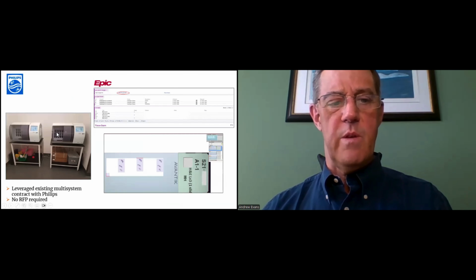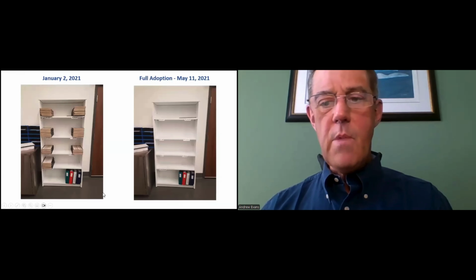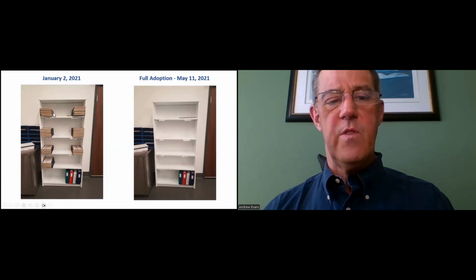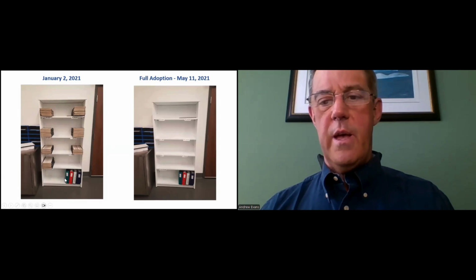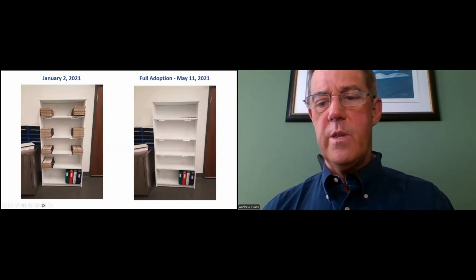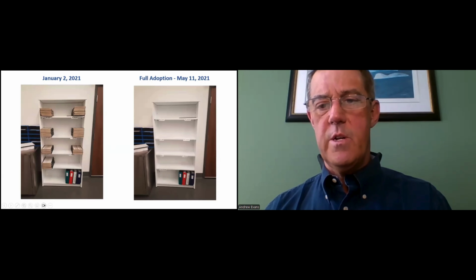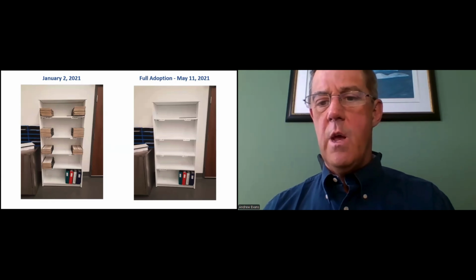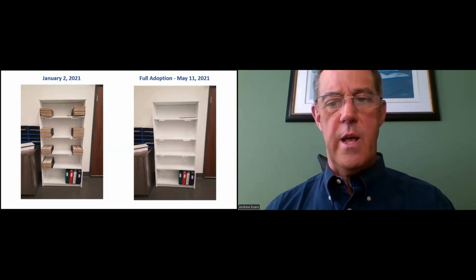This is our system. So we have Philips scanners integrated with Epic AP Beaker. And this is the slide I show quite frequently about what full adoption looks like. So prior to full adoption, glass slides were dropped in pathologists' boxes. And then this is what it looks like now. The only slides that come in through there now would be cytology, wet hematopathology, consult cases that come from outside of Mackenzie Health, or cases where there were image quality problems and pathologists needed glass slides to review.